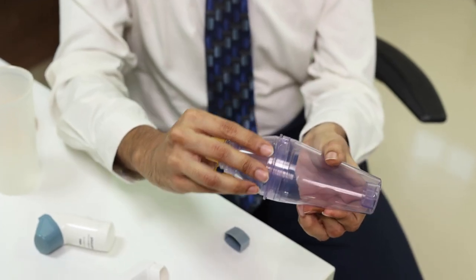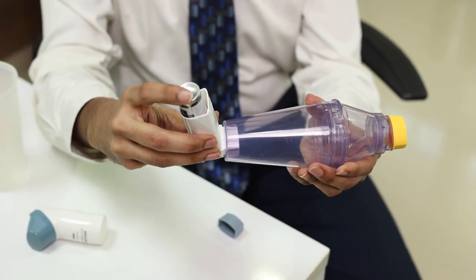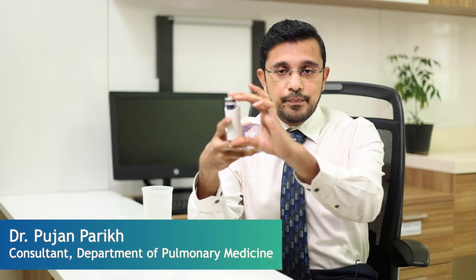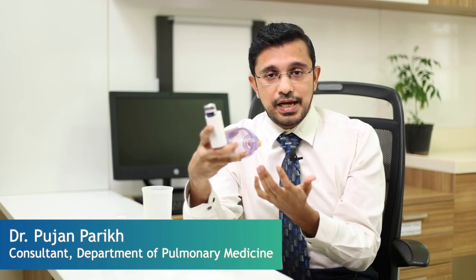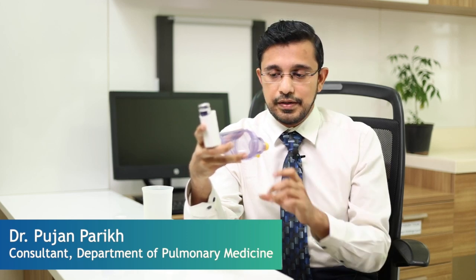So this is how the spacer looks. We have to attach the inhaler to one side like this, keep the other side, that is the mouthpiece, in the mouth and press the inhaler once or twice as prescribed. The patient has to take a deep breath, hold the breath for a couple of seconds, then breathe out into the same device. They can do this 4 to 5 times so that the entire drug gets delivered into the lungs properly.